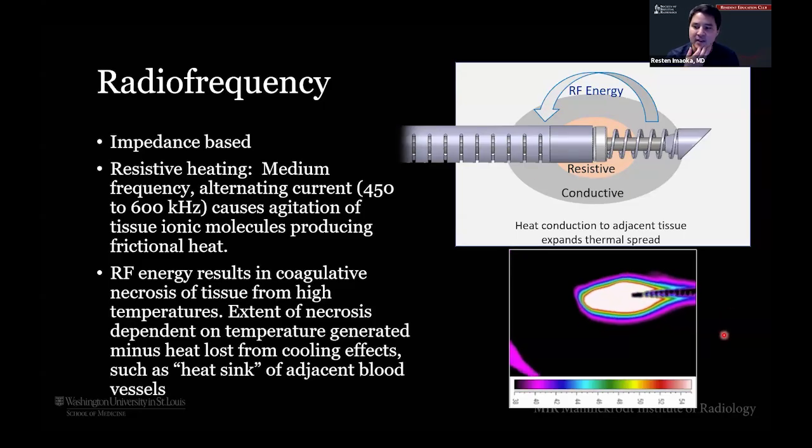But when we talk about things like heat loss, it depends a lot on tumor histology or adjacent blood vessels. Tumors that we know are very vascular, and we think of things like clear cell renal cell carcinoma, medullary thyroid, stuff like that, because they're so vascular, you'll experience a lot of this heat sink, and it may take longer to get the desired temperatures. So here you can see what that looks like, right? The temperatures at the center of the ablation zone and how that expands out here.